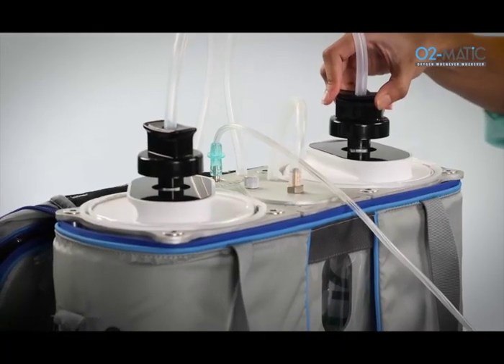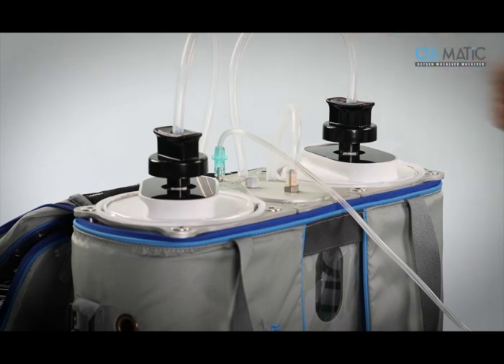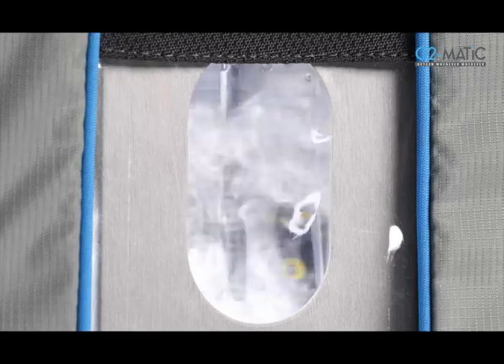A twist trigger is provided on the cartridge. Simply twist to fit the trigger in the corresponding slot in the cartridge and the oxygen production starts.